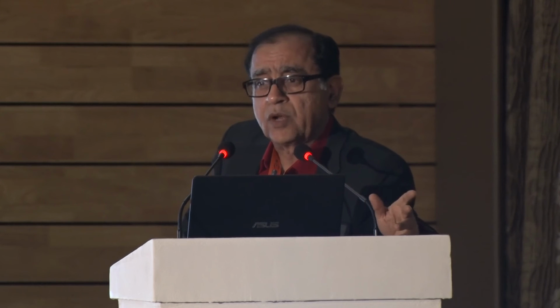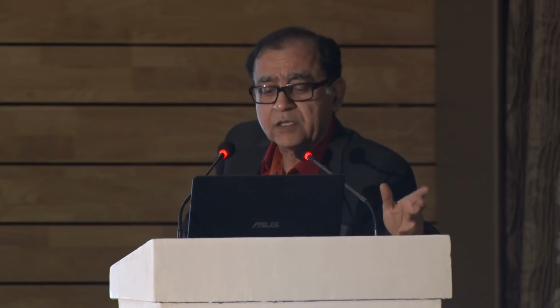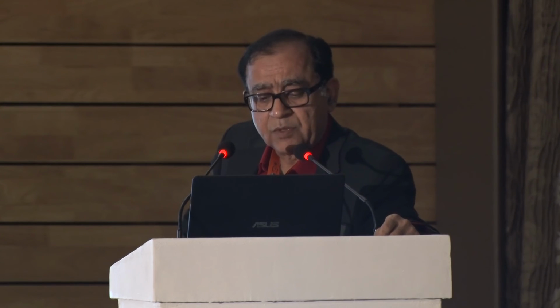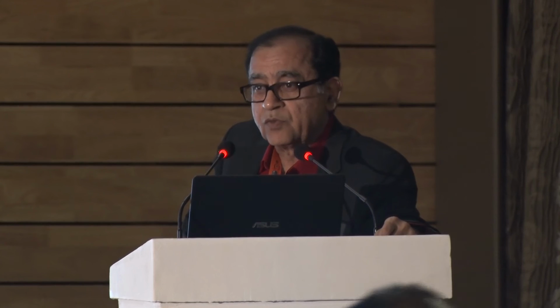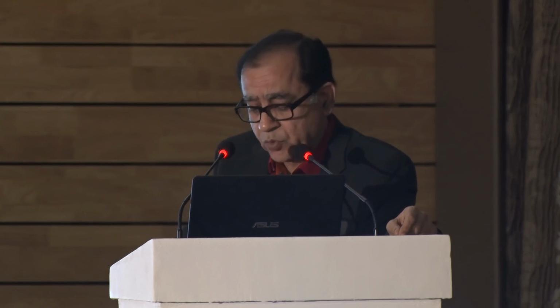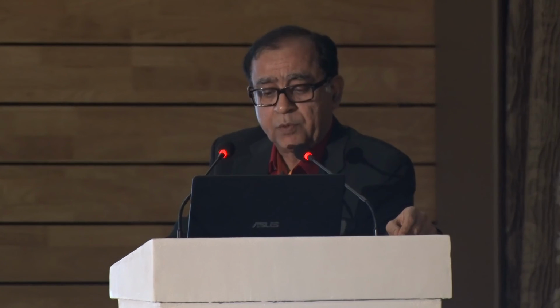And after doing the Zeptorhexis, the pupils become small and we put the Malyugin ring afterwards. And the Zepto has got an advantage that even in spite of the fibrous capsule underneath, the capsule is cut on top of it. It is a fibrous block which is underneath this. So we removed this fibrous block by scissors, and once we placed the lens inside, because his basic concern was cosmesis, we thought given this might come into the center, so we removed the remaining fibrous block as well. So the Zepto can be performed even in small pupils, that is the advantage.